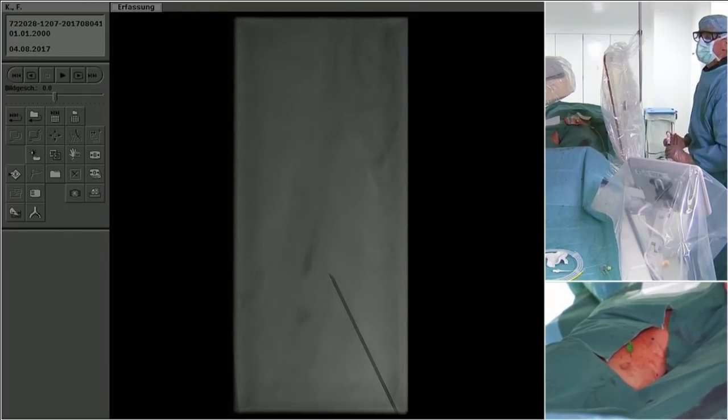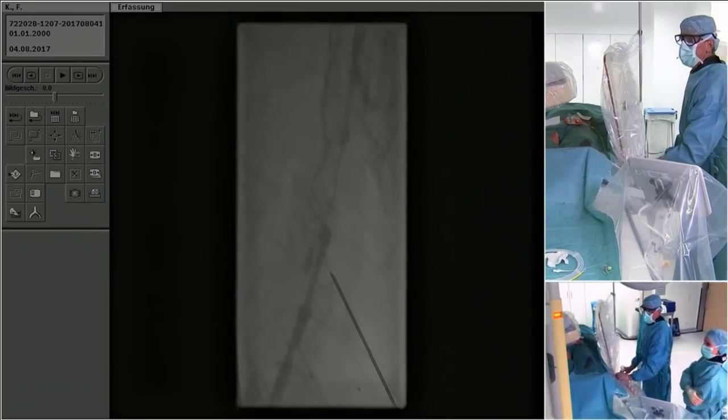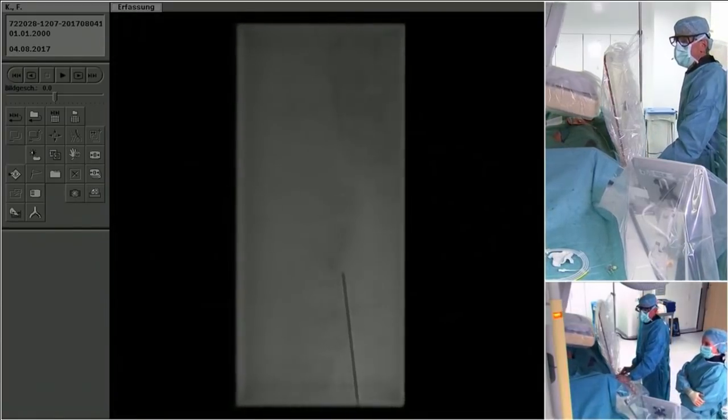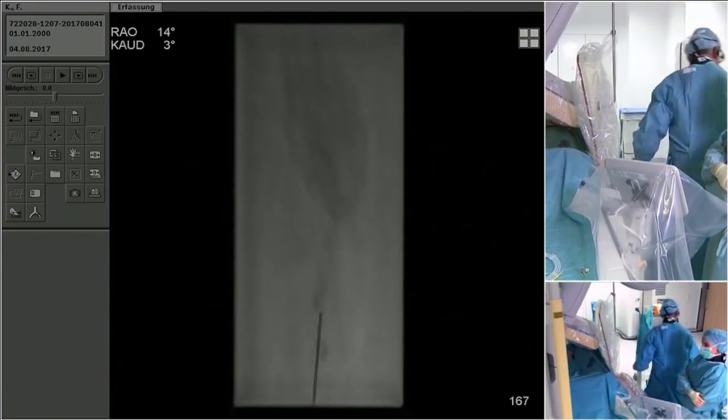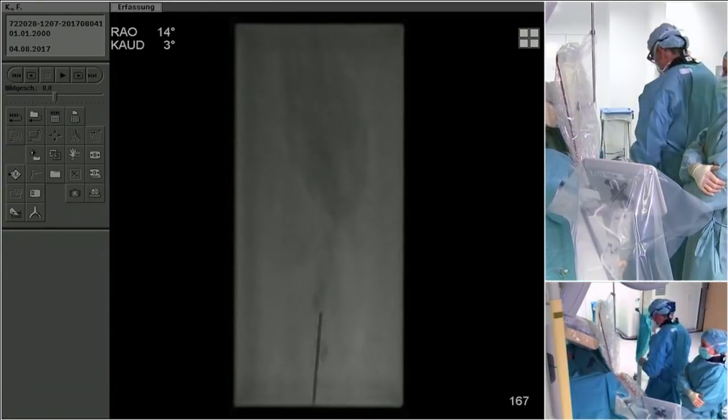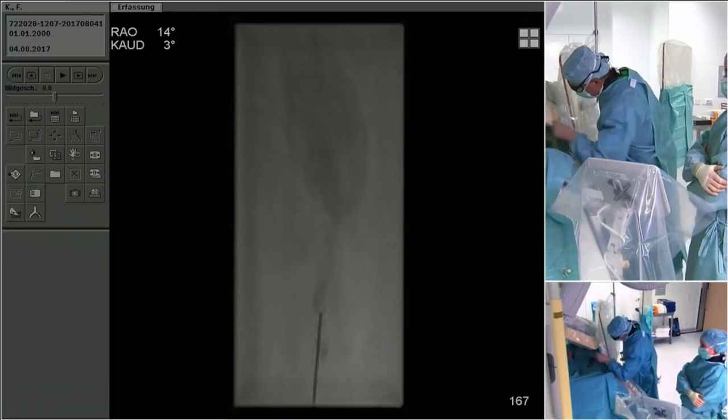There is very little popliteal left, or would you actually, in rare situations, put the patient prone and plan the procedure that way? No, I never put the patient prone anymore. So it's either frog leg or it's an anterior P3 puncture between the tibia and the fibula. Any comments, Christian, Ehrin, Munier?